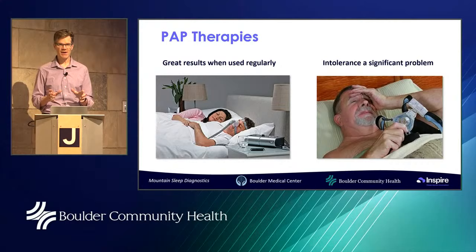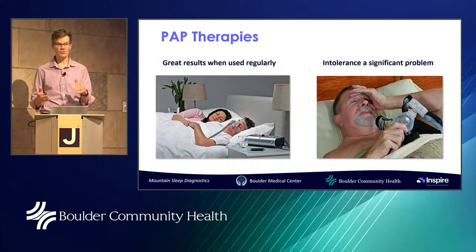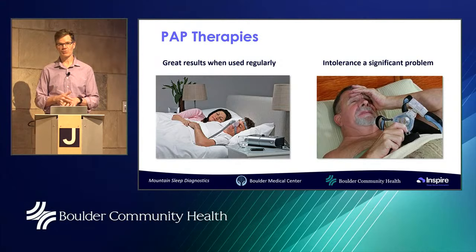The modern CPAP devices actually record your breathing when you're on the machine, and they can give us data on whether the CPAP is effective. You'll often be offered a smartphone app by the company that provides the CPAP, which hooks up to your unit. Every morning you can wake up and see whether it was leaking, whether it was effective, and you'll know right away. I'll know when I check a download. I can make changes to the CPAP machine through cloud-based technology, so I can see whether it's effective and make a change on the fly. So from the time I see you after a sleep study and decide you need CPAP, you could know whether it works within as soon as a week or two.